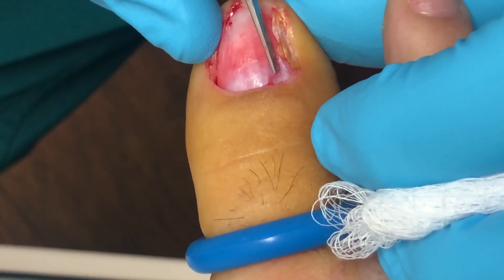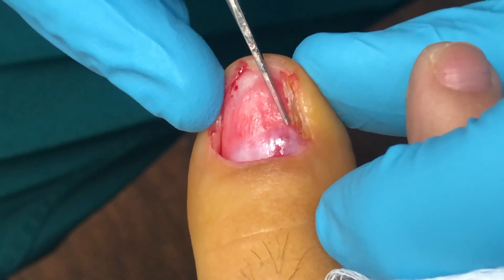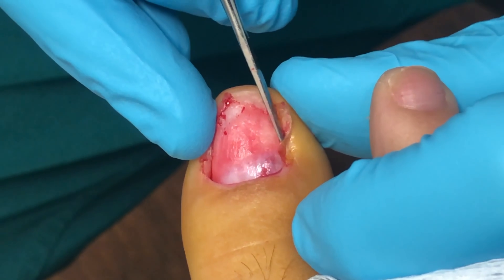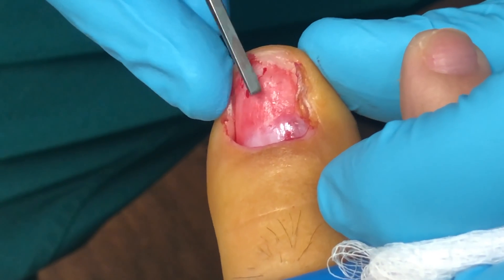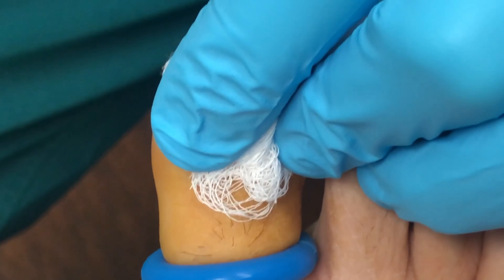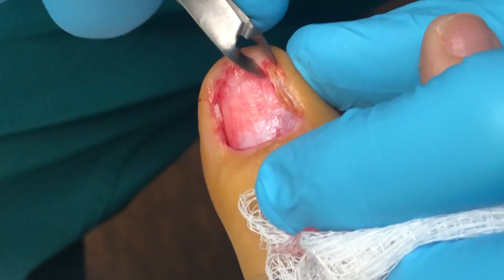So you can kind of see right here — it's discolored. That's kind of where that little bulbous area is. So I'm going to clean this part up. This is like excess skin, most likely from the previous procedures, and then we'll kind of cut that guy out. It's probably going to bleed pretty well, I would assume, because it looks a little vascular. There's definitely something there.